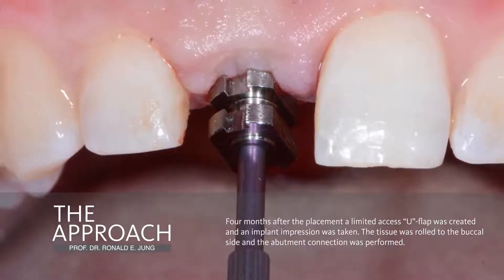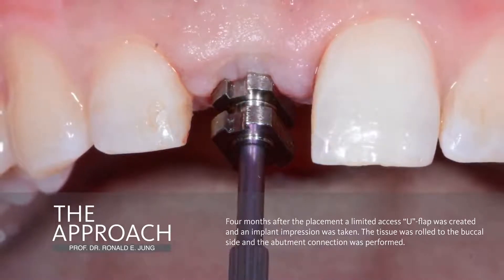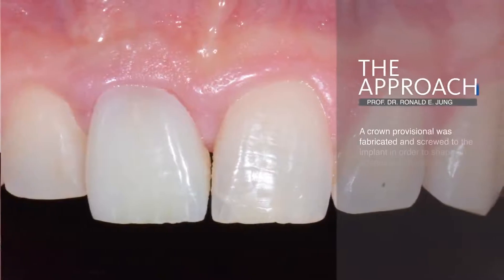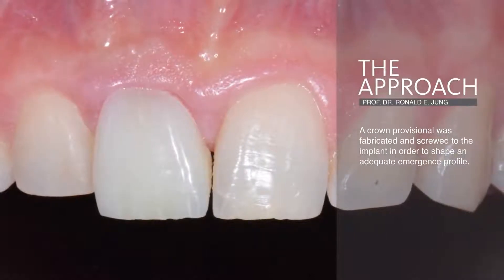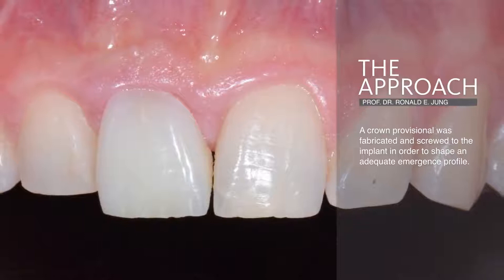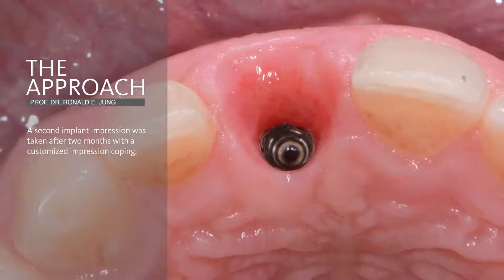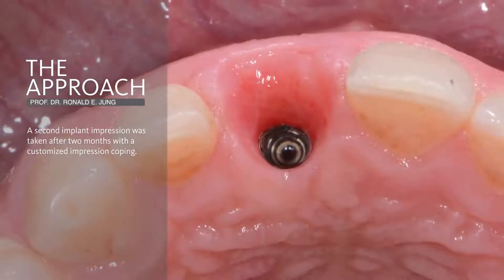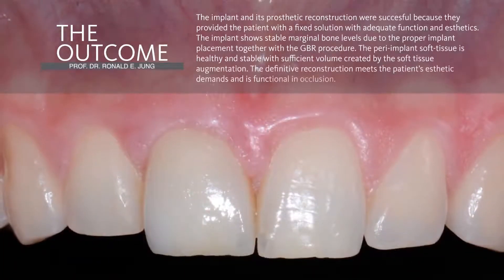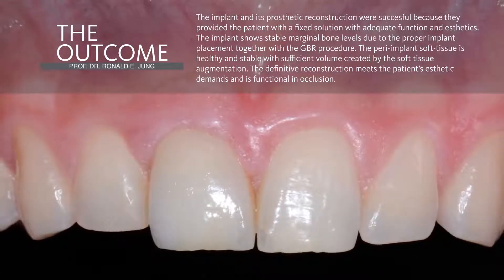After a healing period of four months, we access the implant by using a U-shaped flap, abutment connection, do an impression, and then place a provisional crown, which needs to be done in order to shape the soft tissue to mimic the neighboring tooth. After two months, we were able to achieve a nice soft tissue contour, and this contour is captured in a second impression in order to fabricate the final reconstruction. The final all-ceramic reconstruction is screw-retained and mimics very nicely the neighboring tooth, with very nice soft tissue quality in this area.